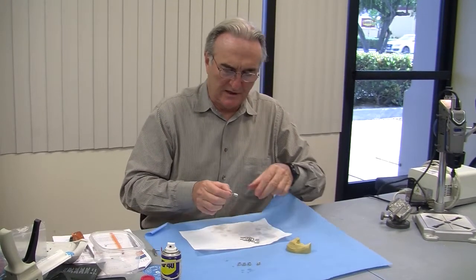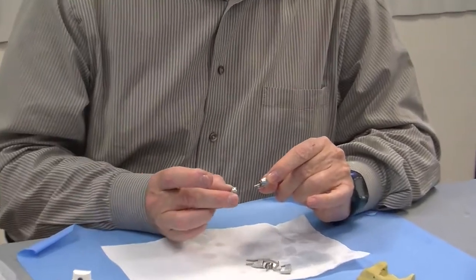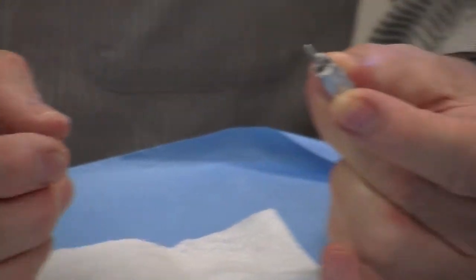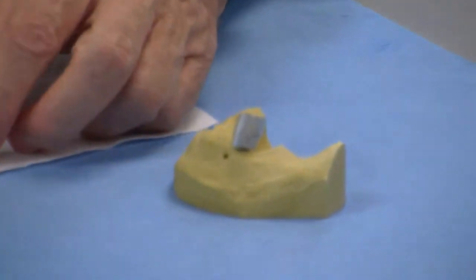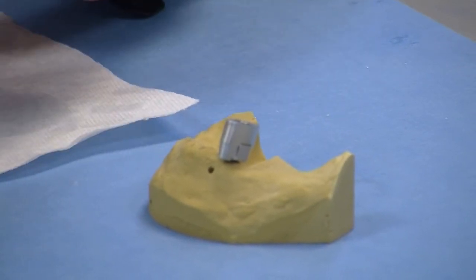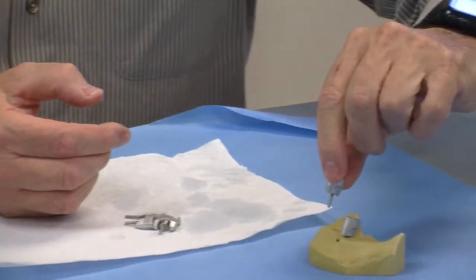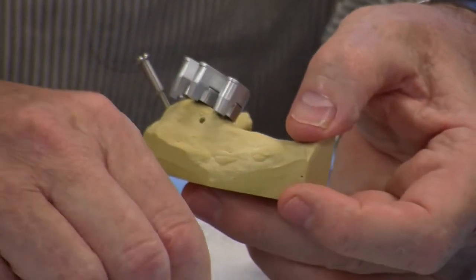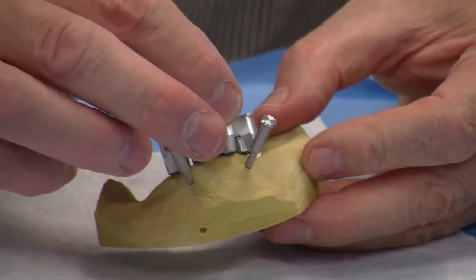The guide holder pins are lubricated using any oil, and the guide holder is inserted with the bevel towards the top of the part. After assembly, this is engaged into the holes which determine the position of the implant. So, number 2. Finally, the fixation screw holder is placed here, and then we can start the fabrication of the guide.